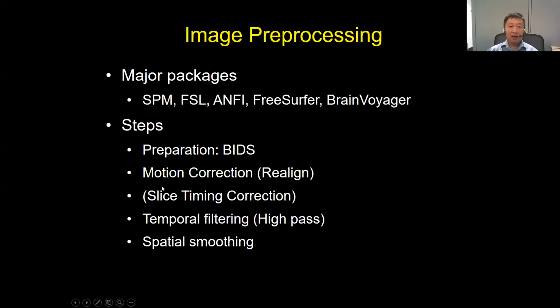So today, the examples I'm going to show are mostly images after pre-processing. The pre-processing steps are not exactly the same, but pretty much similar among the major analysis packages.